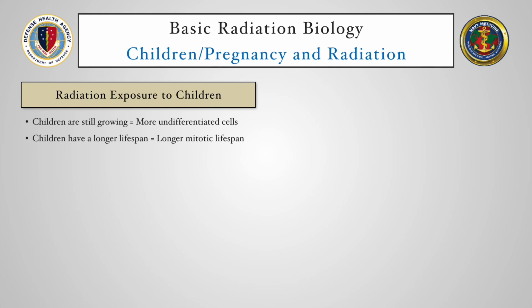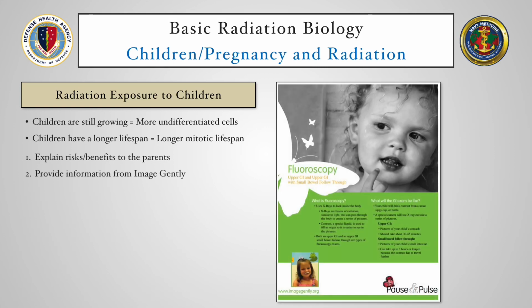Families should receive information describing any diagnostic imaging study before the day of the examination. The physician who requests the examination or the hospital or the facility personnel can provide this information at the time of scheduling. Providing parents with simple brochures before the procedure is shown to improve parents' understanding. And on the screen, you can see an example from the Image Gently campaign of a GI barium swallow fluoroscopic examination.